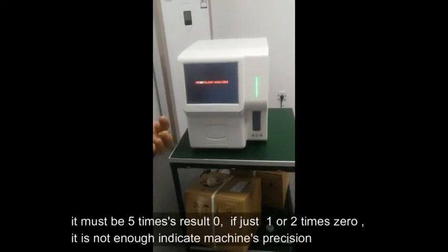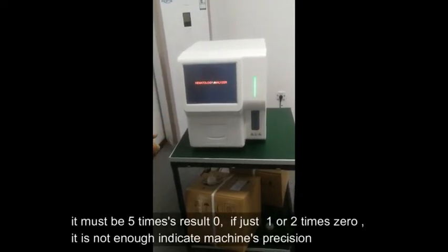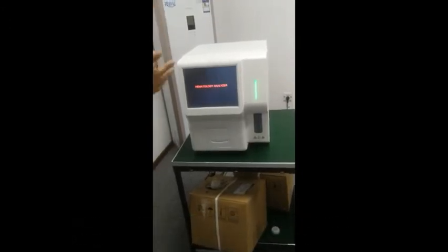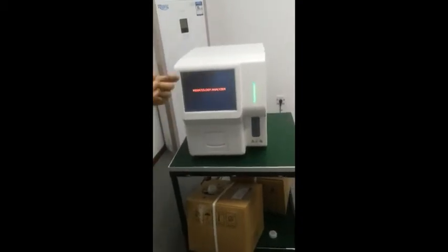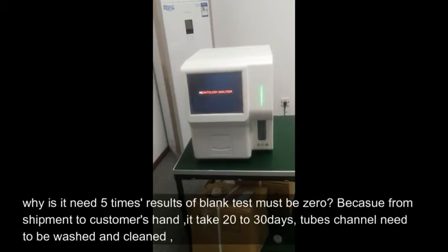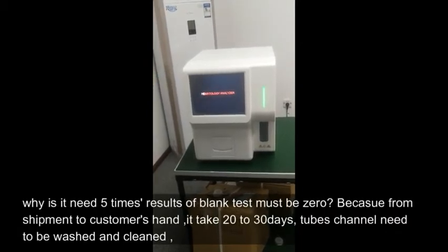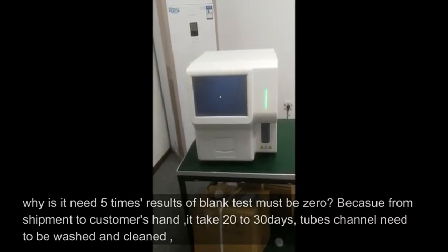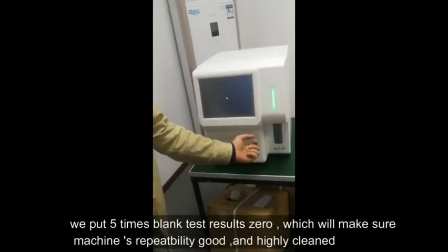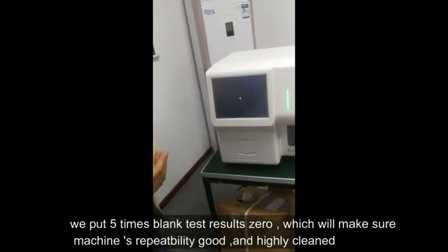It must be 5 times with a result of 0 — if just 1 or 2 times show 0, it is not enough to indicate the machine's precision. Why does it need 5 times? Because from shipment to the customer's hands it takes 20 to 30 days, and the tube channels need to be washed and cleaned. Five blank test results of 0 will ensure the machine's repeatability is good and it is highly cleaned.